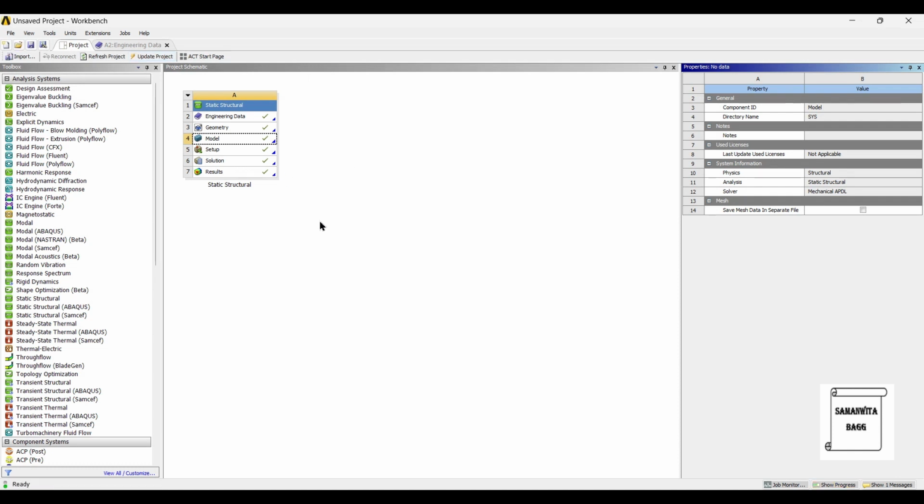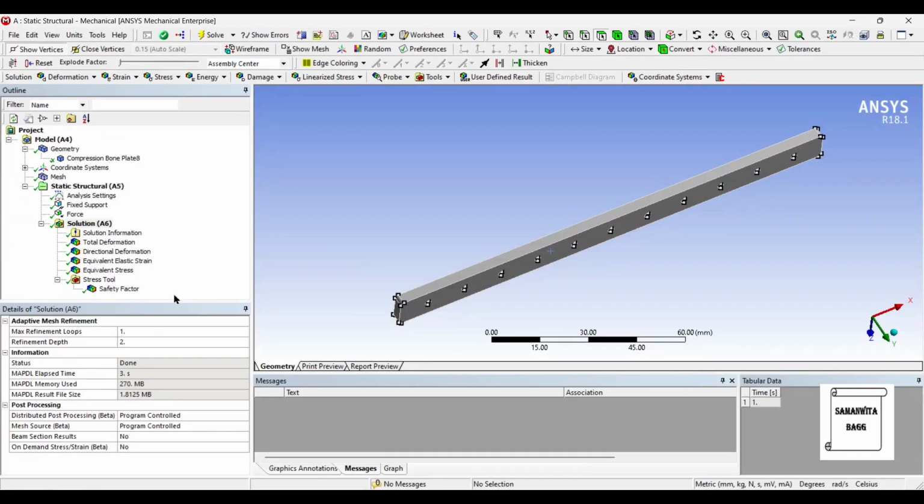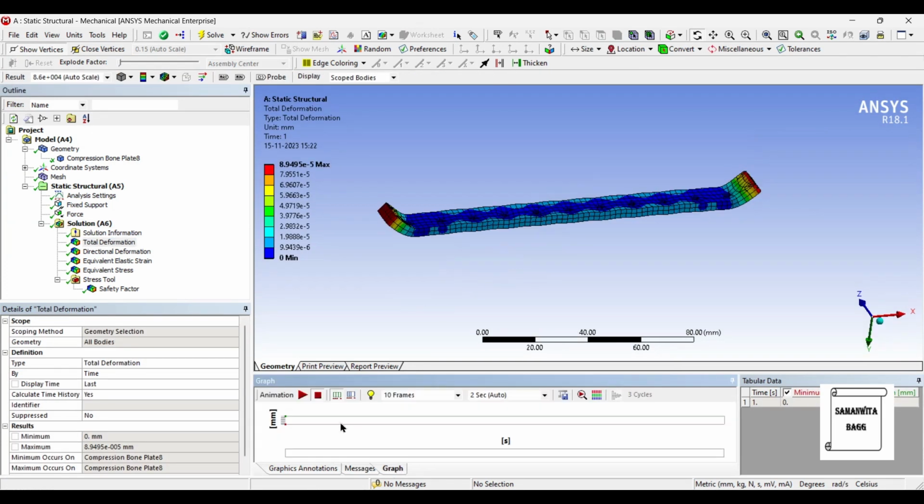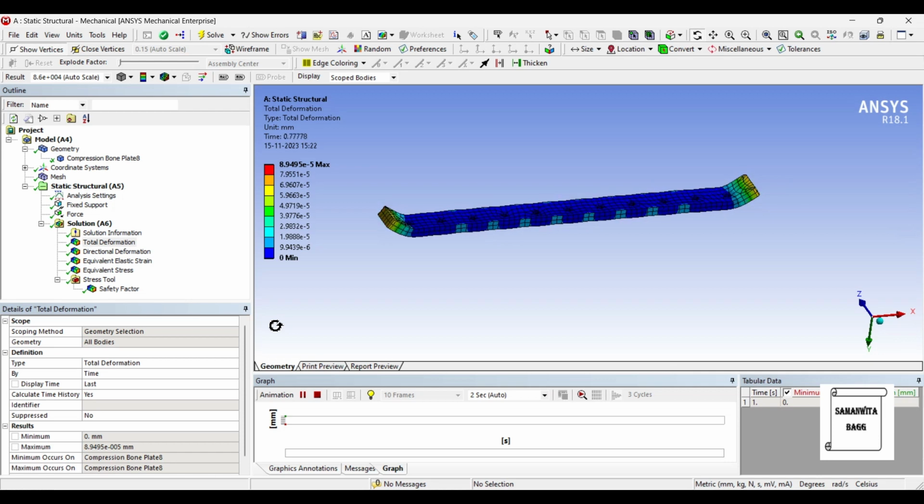Since the data is the required value, you can see here all the solutions have been obtained. So I'll come back to the solution. I'll go to total deformation. You can just animate and check the result. The maximum value of deformation is 8.949 into 10 raised to minus 5 mm.